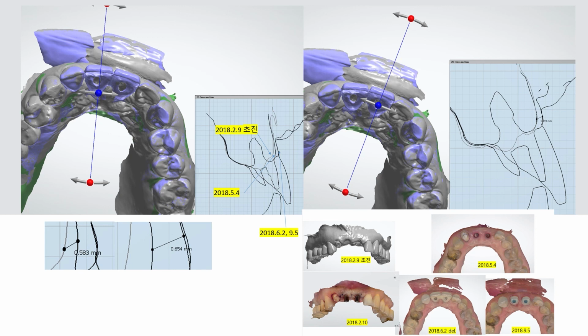Compared to the initial visit, using the temporary and then a narrow stock abutment and doing remodeling resulted in more volume increase. And since then, with the screw temporary, the buccal bone actually grew by more than 1 millimeter. Then, after 3 months using the temporary, would that 1 millimeter that has been gained collapse?